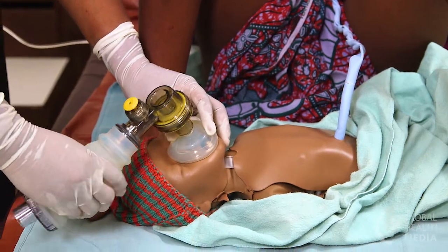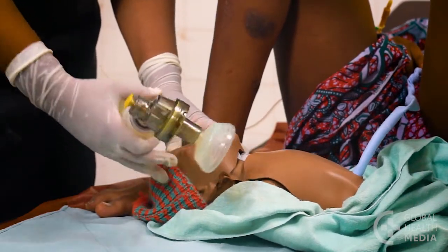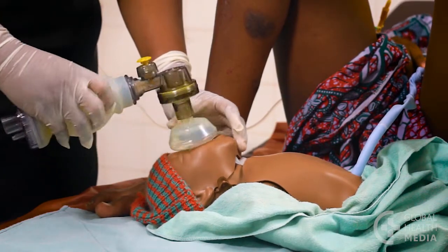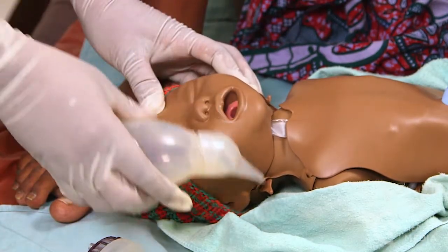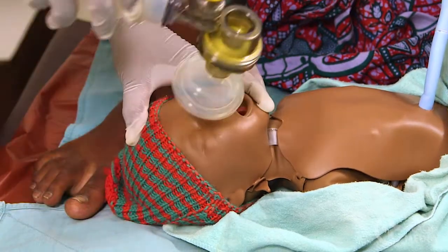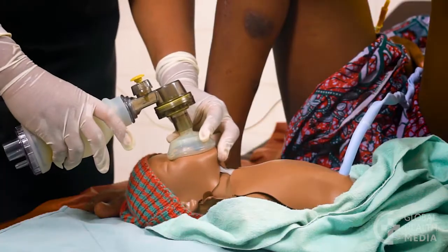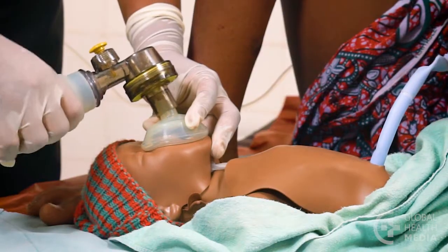Here are actions you can take if you notice the chest is not moving with the breaths you are giving. First, reposition the baby's head, then reapply the mask and give two or three more breaths. If the chest still does not rise, clear secretions from the mouth and nose and open the mouth a little, then try again to give breaths. If there is still no chest movement, squeeze the bag a little harder to give a larger breath. That worked — now the baby's chest is rising.